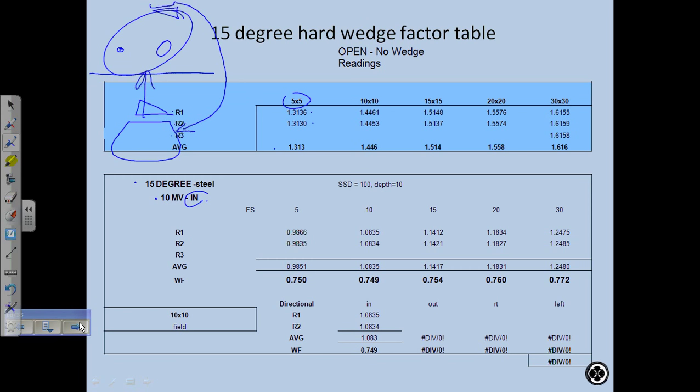So just think of this thing rotating. Where does the toe go? Well, the toe stays on that side. So that's a right wedge. Anyway, get used to thinking about that when you're doing treatment planning. It's quicker, because if you put the wedge in the wrong direction, of course you can always look and verify that it's what you want. But it also helps if you could do that ahead of time.